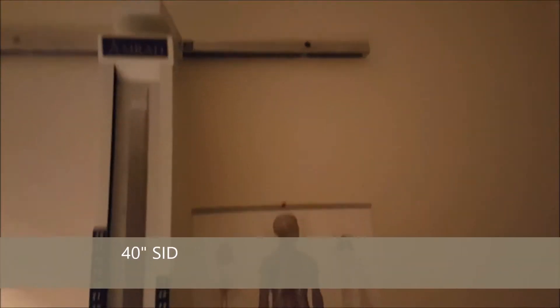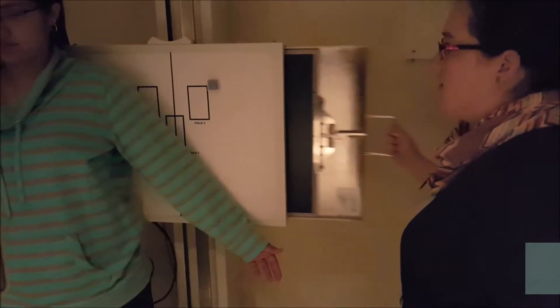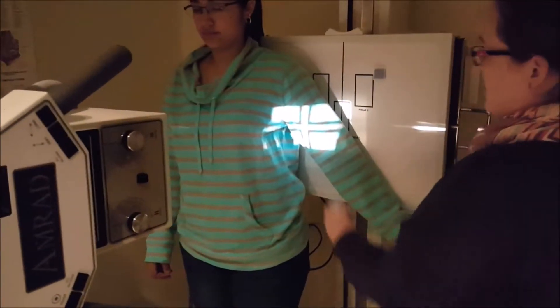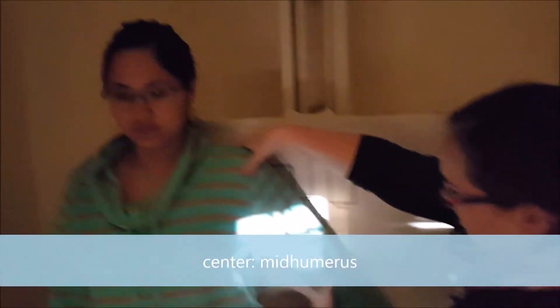For an AP Humerus, we're going to be at a 40 inch SID, we're going to be using a 14 by 17 cassette, we're going to put this in portrait. We're going to be centered to the mid-humerus — her elbow is here, her shoulder is here, so we're about centered there.